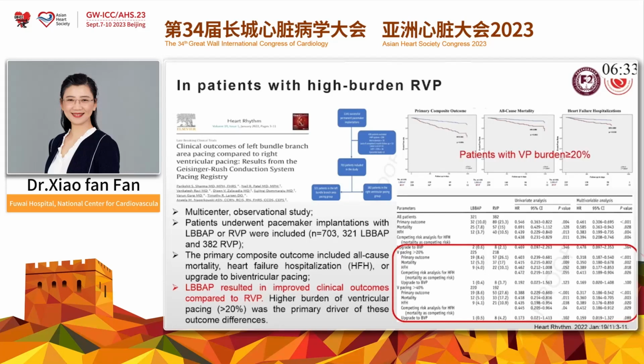And this study studied the patients with high burden RVP, high burden of VP%, I think. And from this study, the patients with RVP and LBBAP were compared.